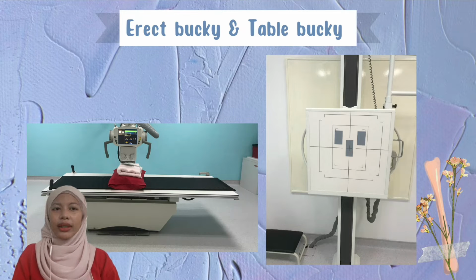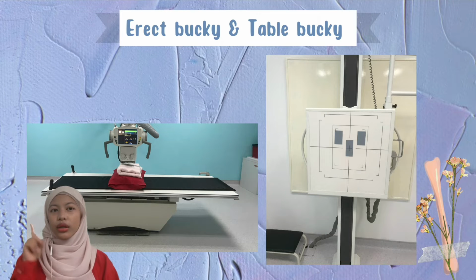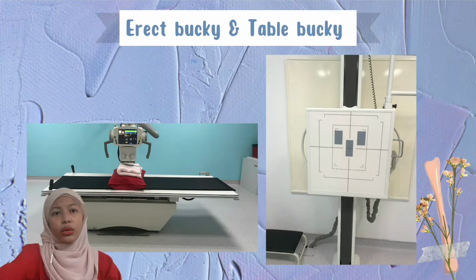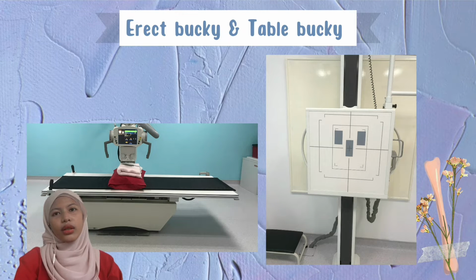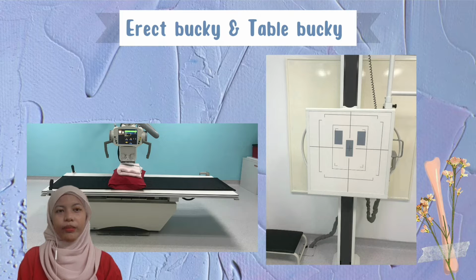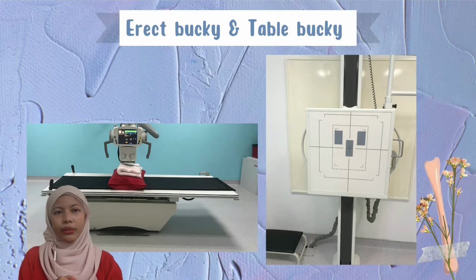The erect bucky and table bucky, of course, will hold the cassette or IP plate. Also, there are supports that will support the patient's position and give comfort. So, what is the difference between the erect bucky and table bucky? The erect bucky is used when the patient is able to stand or sit, which is called erect projection or semi-erect projection.